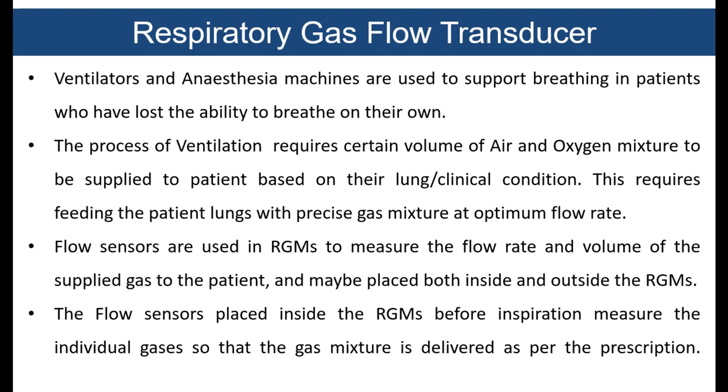Now we are going to see the respiratory gas flow transducers. As the name suggests, we are going to deal with respiratory gas flow, which concerns the respiratory system. When talking about a respiratory system, two machines come to mind, very commonly: ventilators and the anesthesia machine. They are the machines targeted for and utilizing these flow transducers. As per the definition, the ventilator and anesthesia machine are used to support breathing in patients who have lost the ability to breathe on their own.